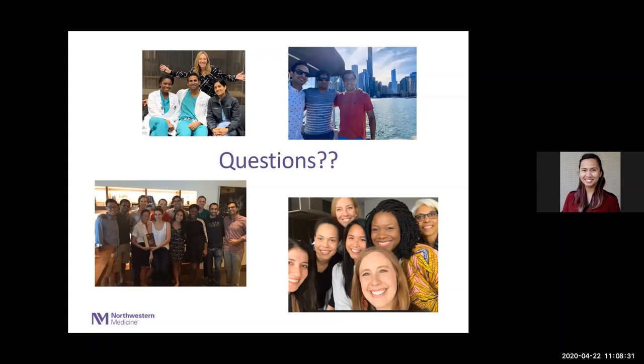One of the slides I have is a BPH patient, one of the next cases, who also has Parkinson's and a lot of irritative and obstructive symptoms. It's tough to know what's going on with those patients. I find them challenging because they have a lot of symptoms related to the Parkinson's, but they can also be a 70-year-old man with an enlarged prostate. So you really want to see, is there obstruction? Sometimes that's where the fluoro helps you in a Parkinson's patient, or your urethral pressure, because they can have a bradykinetic external sphincter, which can look like outlet resistance. But if on your imaging you don't see the bladder neck opening at all, it's much more definitive that there's a prostate issue.